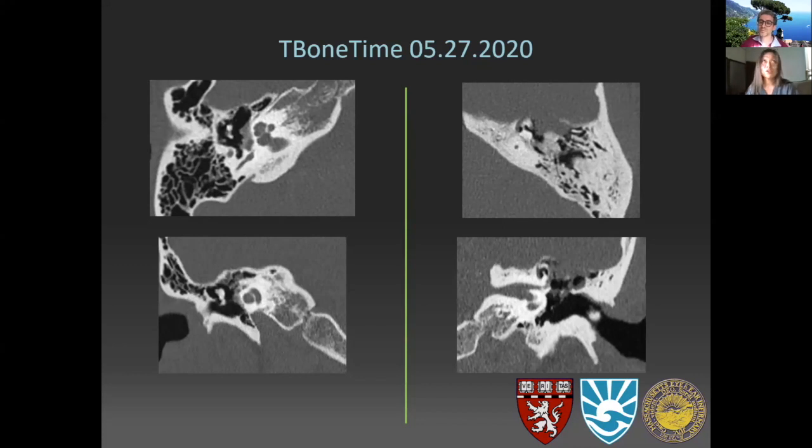Yeah, so I'm not sure about in the literature, but interestingly, the resident at MGH, who I think is on this webinar, and my co-worker and colleague, Catherine Reinshagen, we did work on an abstract where we were looking at density measurements of different areas around the otic capsule, and we wanted a normative location to say what would be considered a normal-ish number so we can compare. At first we were like, oh, let's pick that bone island in the middle of the lateral canal. But it turns out that we run into the problem you're exactly describing, where it's smack in the middle.